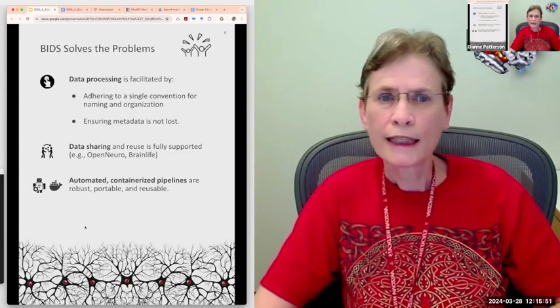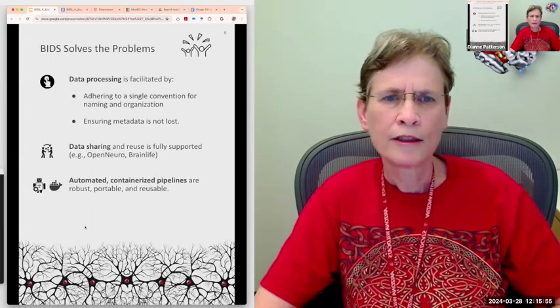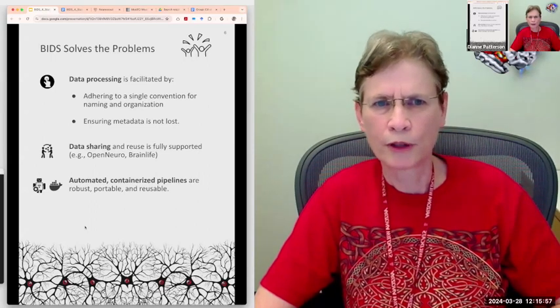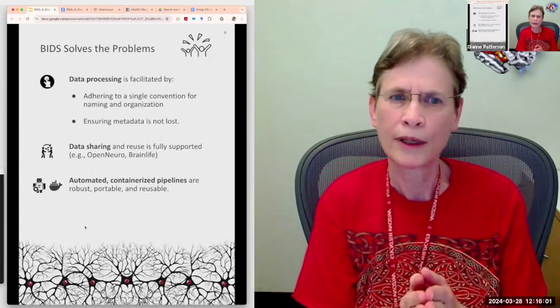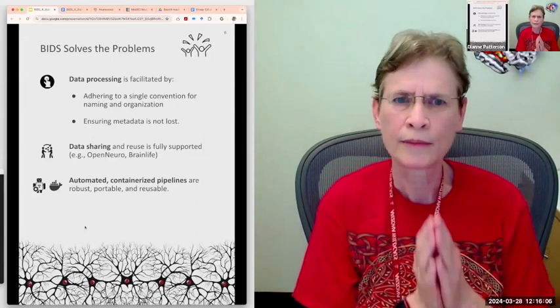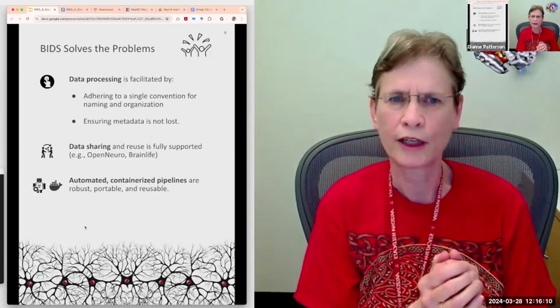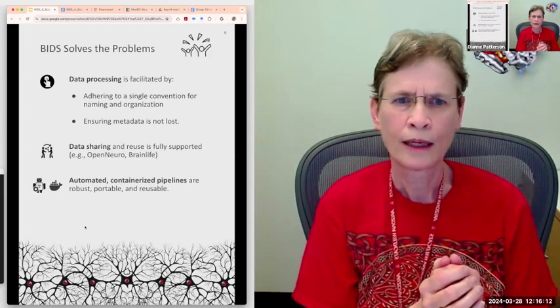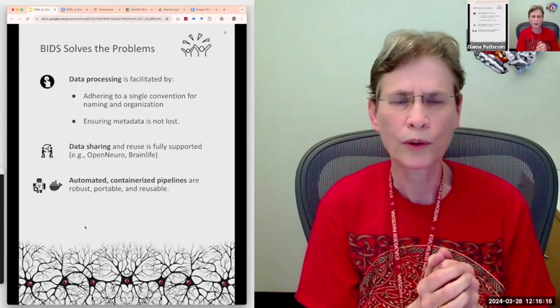So by providing a single convention for organizing and describing MRI data, BIDS solves the problems I described earlier, right? Data processing is facilitated because each BIDS app knows exactly how the files are named and organized. Each BIDS app can also use the metadata stored in the JSON sidecars. Data sharing and reuse is fully supported, and that's becoming more and more important for all of us.